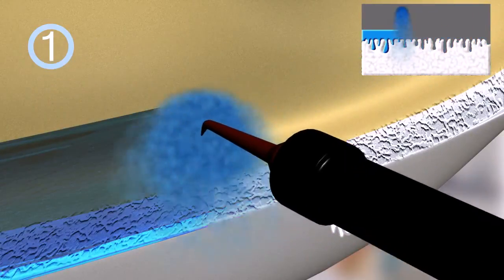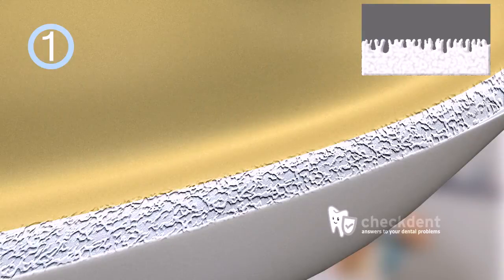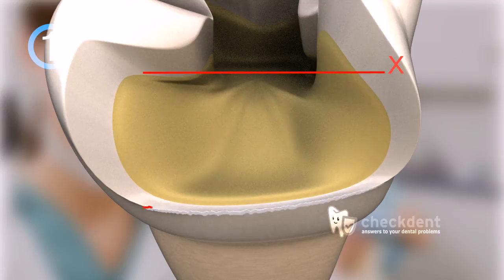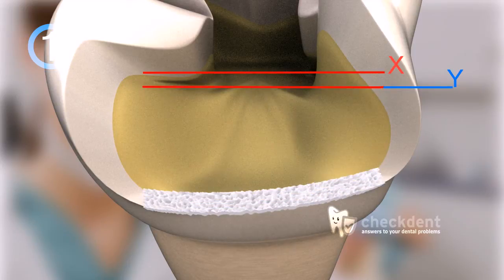These structures remain even after the etching gel is rinsed off. Let's assume that the initial surface of the tooth, including that of the inlay, amounts to a length of x. Examining the gluing surface closely after the etching procedure will reveal that this surface has expanded by a factor of y. Because the etching pattern is three-dimensional, the gluing surface is actually enlarged more than what is observed.